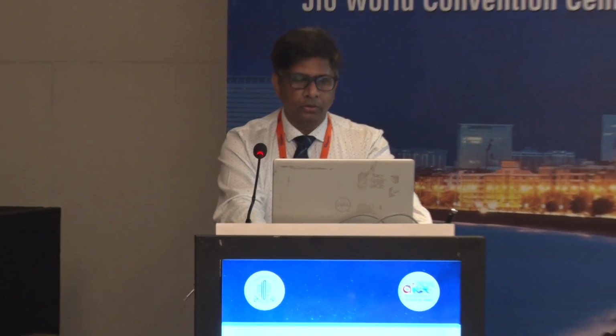And this is basically a representation in the topography, where the warmer color orientation gives whether it's with the rule or against the rule or oblique astigmatism. Now, there are problems with astigmatism. They can cause blurring of vision, distorted vision, eye strain, headache, discomfort, and whatnot. So if we get the scope of correcting that, why not?